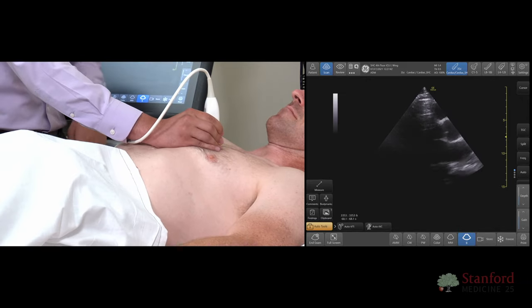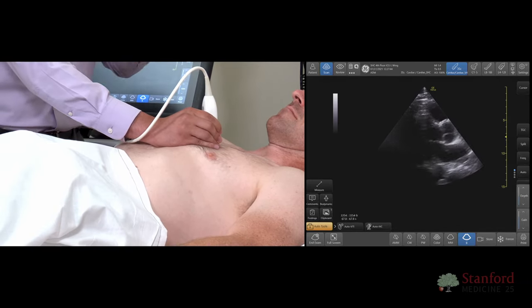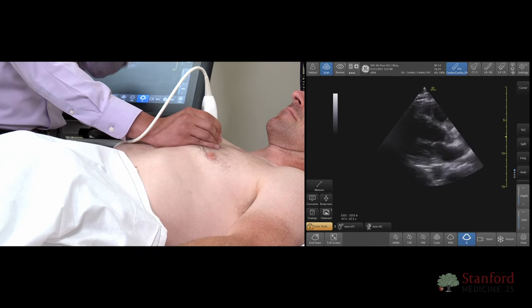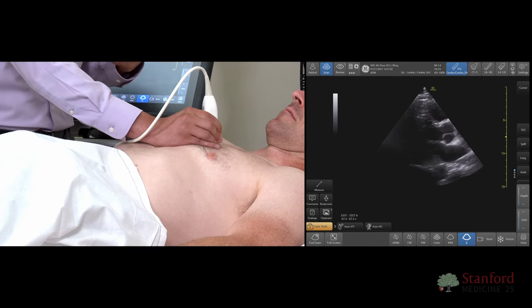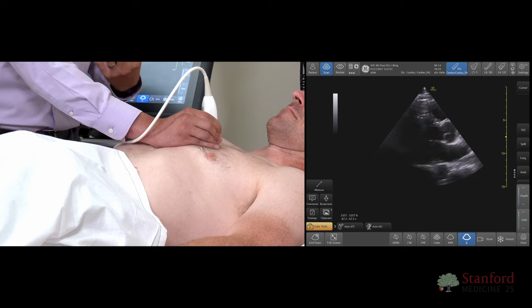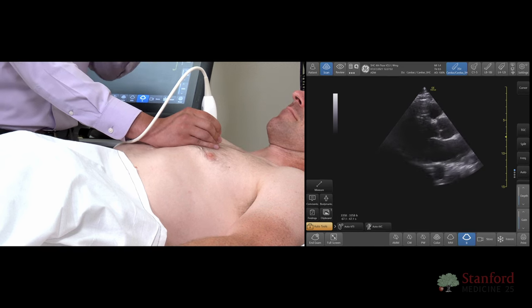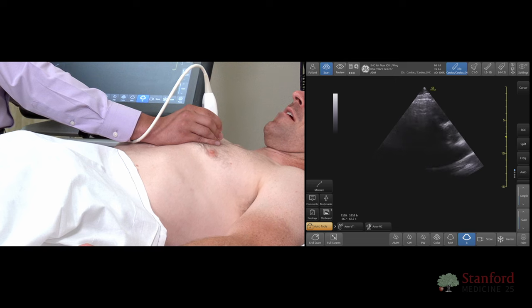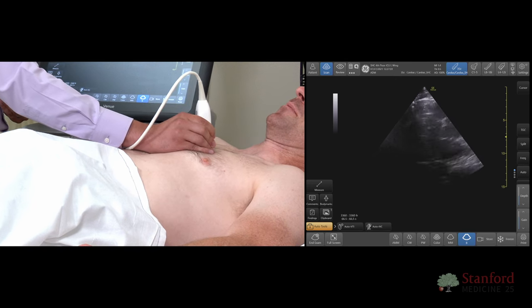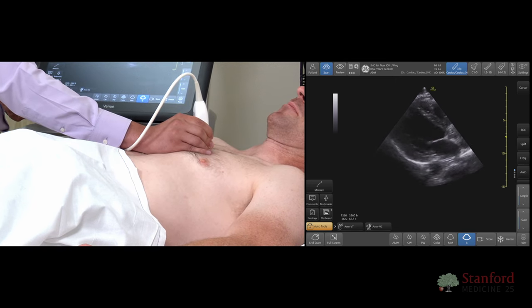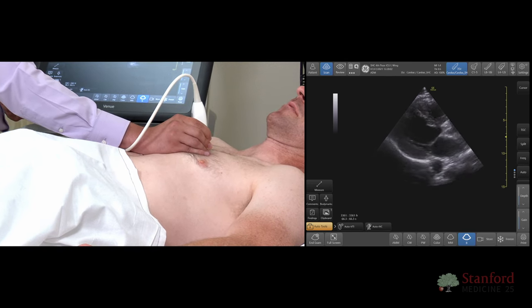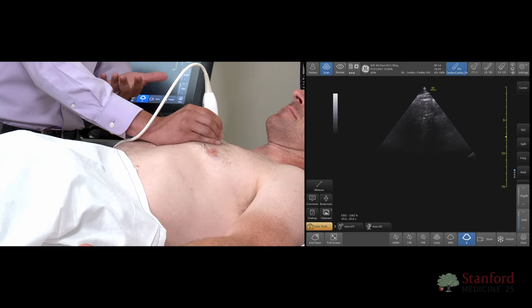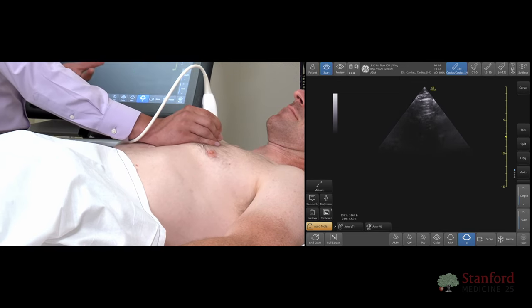Another common thing that can happen is if you have a patient who has a lot of air, or you're just seeing a lot of A-lines in the lung, you can have the patient exhale fully, which deflates the lungs and may bring the heart into an easier view. If you do this, just be sure to hold your breath alongside the patient's. Go ahead and exhale. By doing that, it allows you to visualize the heart a little bit easier.